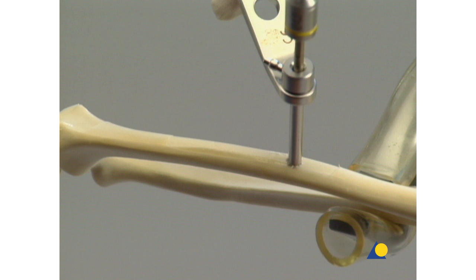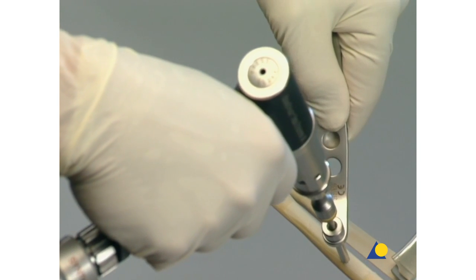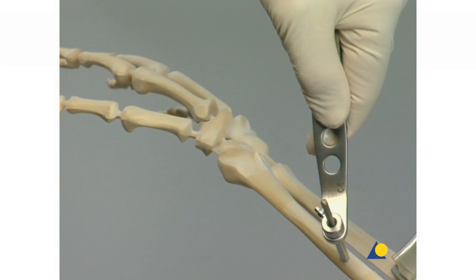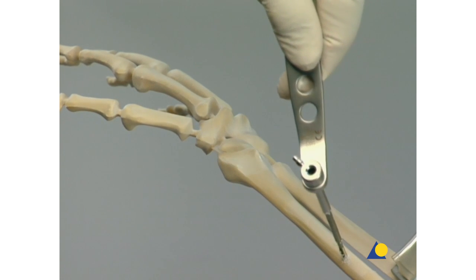The image intensifier can be used to check the final position of the Schanz screws. The tip of the self-drilling Schanz screw must be anchored in the far cortex to ensure stable fixation. Penetration of the far cortex is not necessary. Once the Schanz screw has been placed, it's released from the adapter and the drill sleeve is removed.